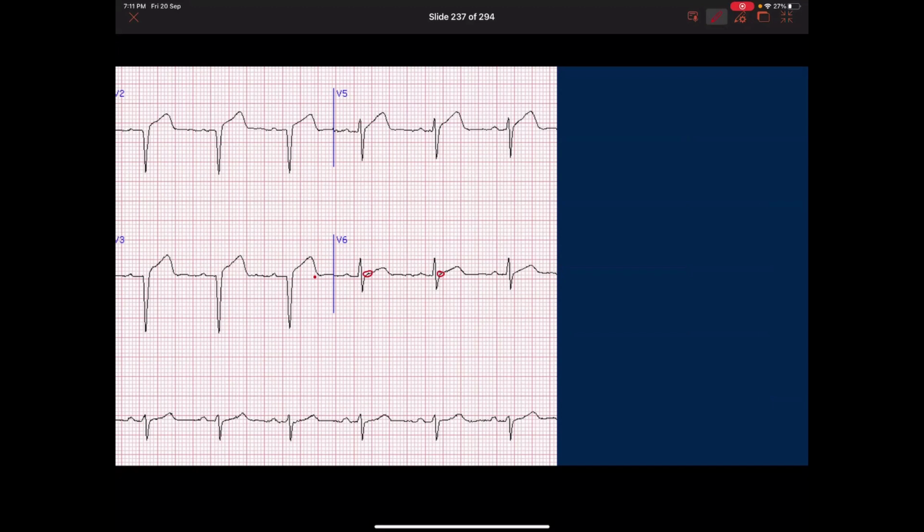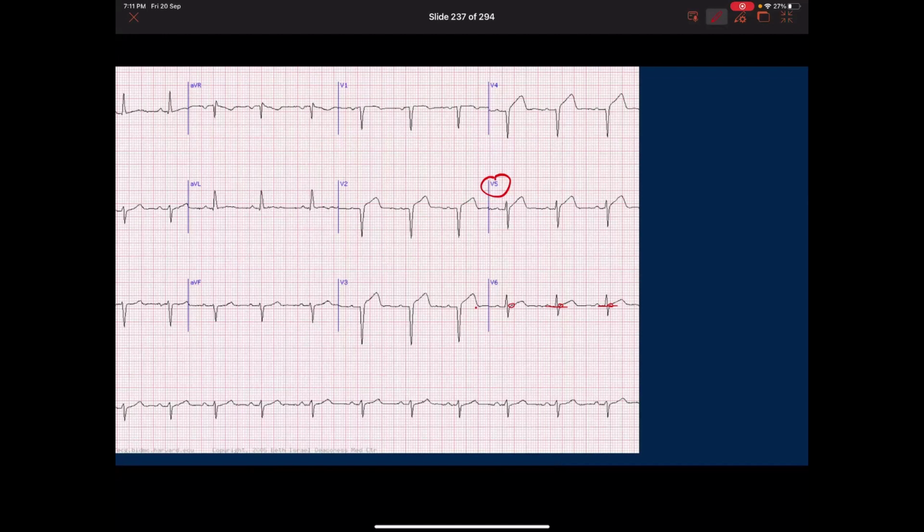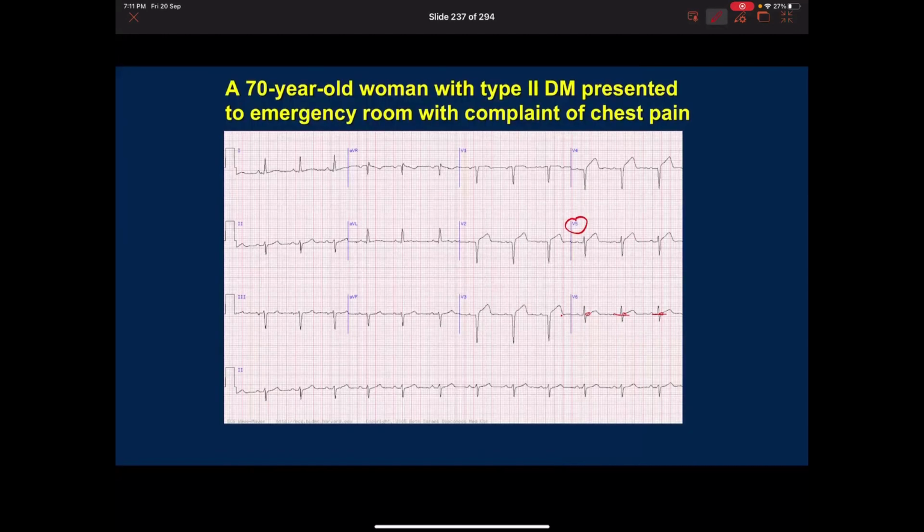And it looks very even on the same line. So I only see it very clearly in 5. So if it's not 5 and 6, we cannot call it lateral. It needs to be 2 consecutive leads. Is that clear?